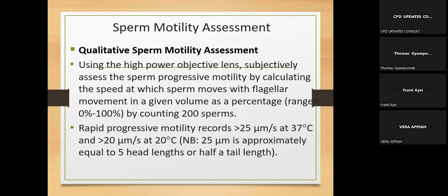If it is getting to 55 or 52, it is abnormal. But if you don't know these dimensions already, how are you going to assess if something is abnormal or not abnormal based on the strict criteria?